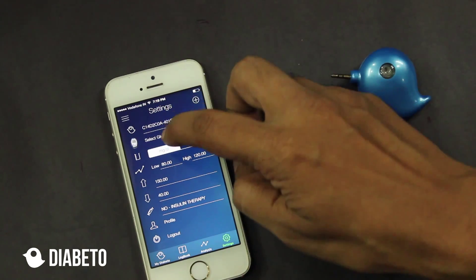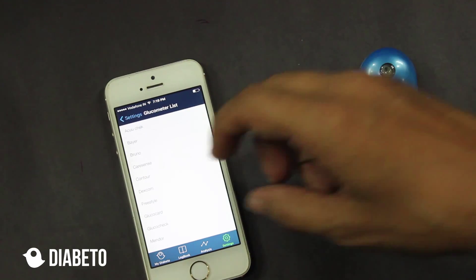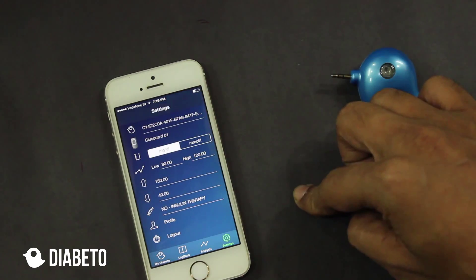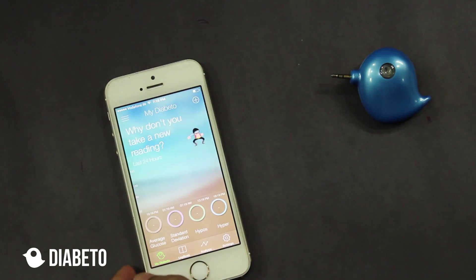The second screen says 'select glucometer.' I'll select — now I'm going to sync Glucocard 01. So I go down, select Glucocard, Glucocard 01. Now since I am in India, it's going to be MG per DL. And now straight away I'll go to the home screen.